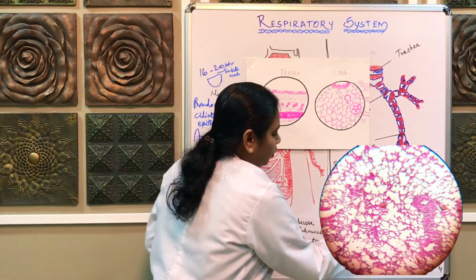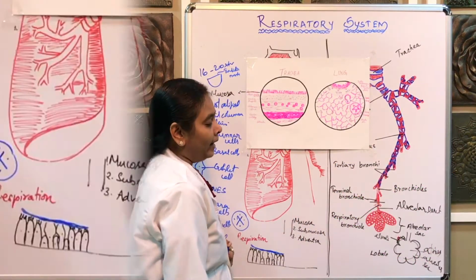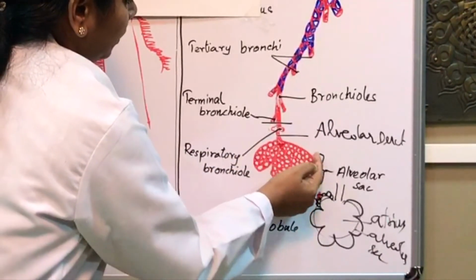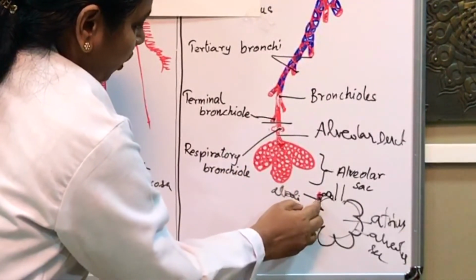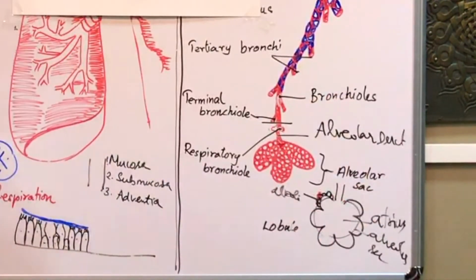So from the alveolar duct there is a blind space called the atrium, and this atrium contains so many sac like things. These are otherwise called alveolar sacs, and each alveolar sac once again is going to form small air pockets, that is otherwise called alveoli.